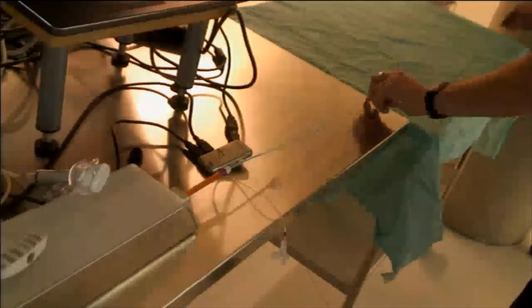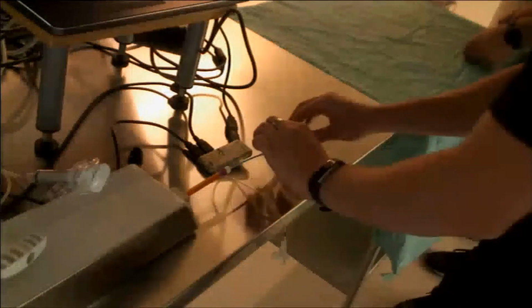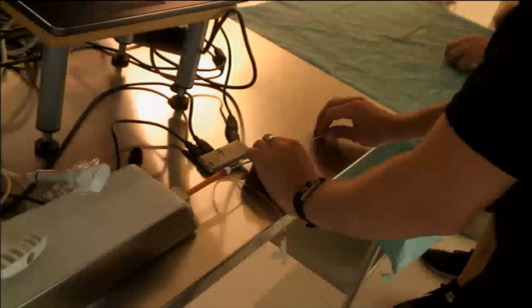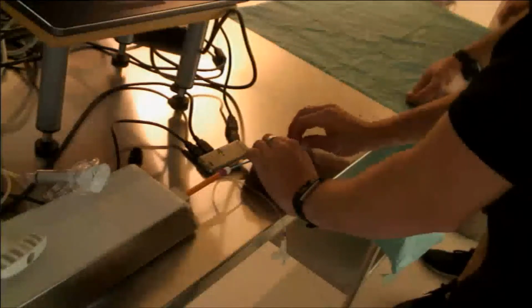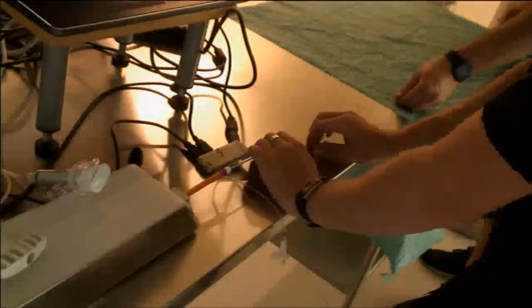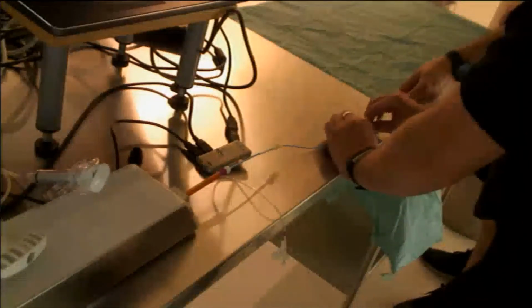With 3 tools in the simulator, removing the guide wire requires the 2 catheters to be fixed in place, which is where your assistant comes in handy. Without an assistant to help me fix the tools in place, I lost my position with the Cobra when removing the guide wire. I've managed to borrow an assistant here to help me regain my position. This allows me to manipulate both of my catheters and also use the X-ray pedal while he fixes the guide wire to the table.